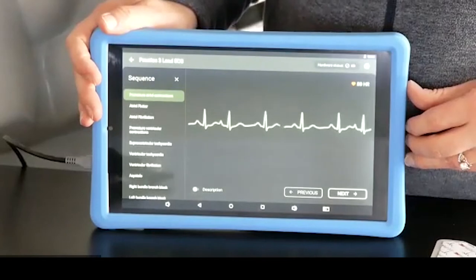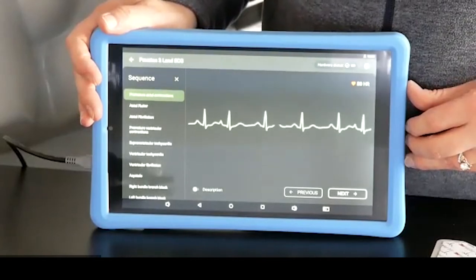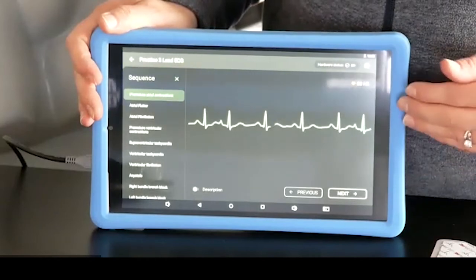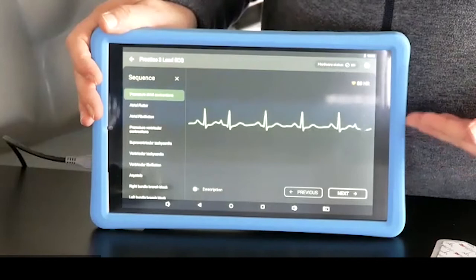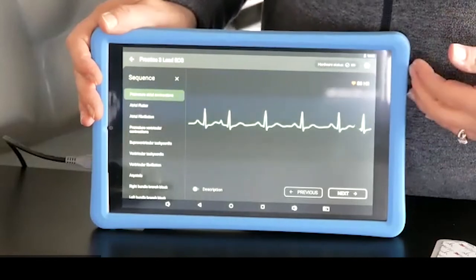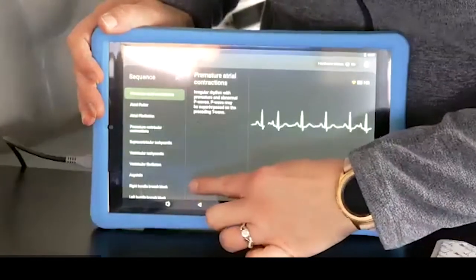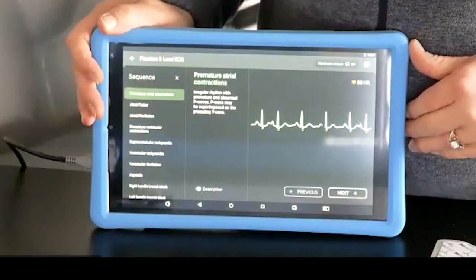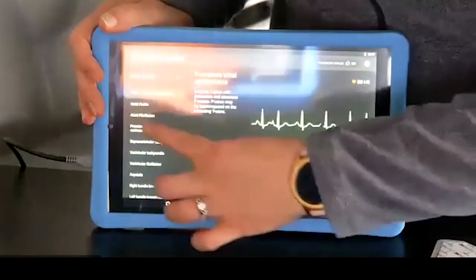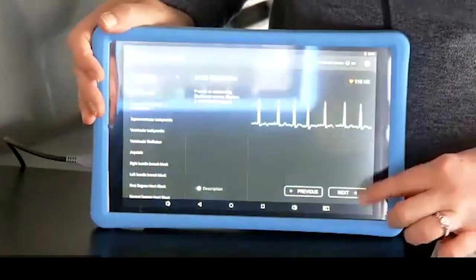After students have correctly placed the 3 lead ECGs on the mannequin, they can progress to looking at rhythms in sequence — basically atrial and ventricular — or in a randomized sequence. This will help them identify rhythms. By clicking on the description, they can learn about the rhythms as well. To change to a different rhythm, they can select any of them or click next.